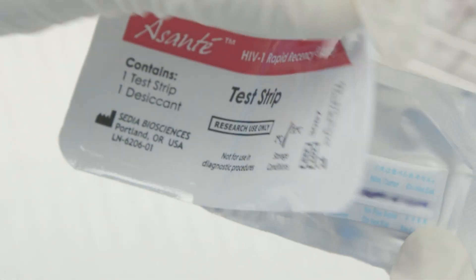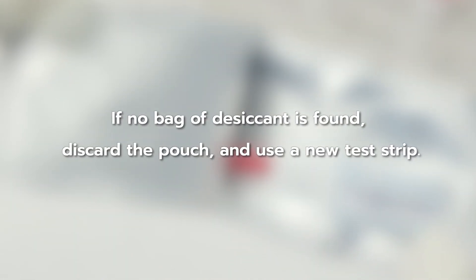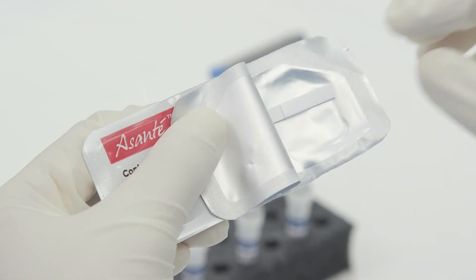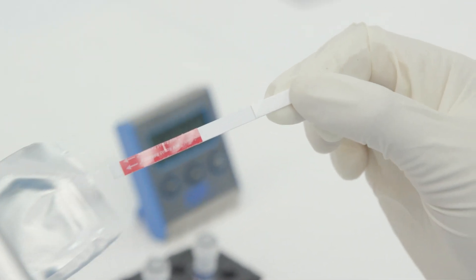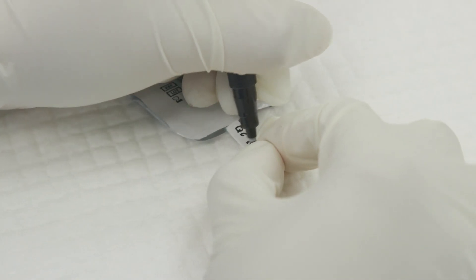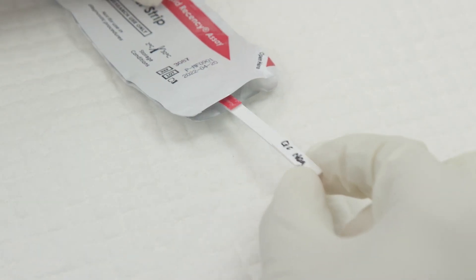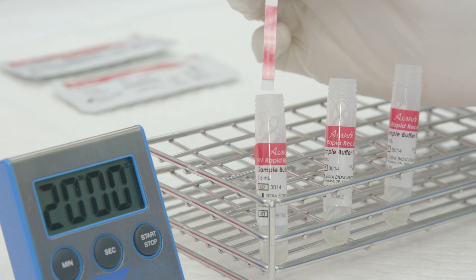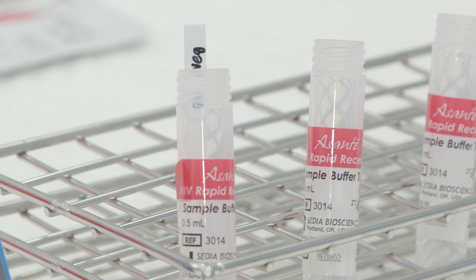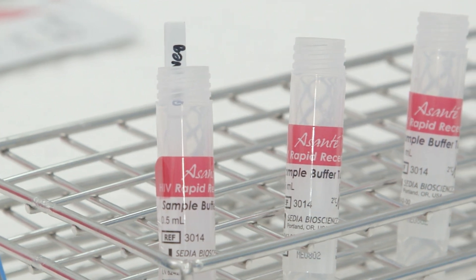Step 7: Open the foil pouch and check if there is a bag of desiccant. If none is found, discard the whole pouch and use a new test strip. Remove the test strip from the foil pouch, being careful not to touch the middle part of the strip. Label the ID of the quality control sample at the tip of the test strip. Step 8: Insert the test strip into the liquid in the sample buffer tube with the arrows pointing towards the liquid. Step 9: Let the sample buffer tube with the test strip stand on a rack.